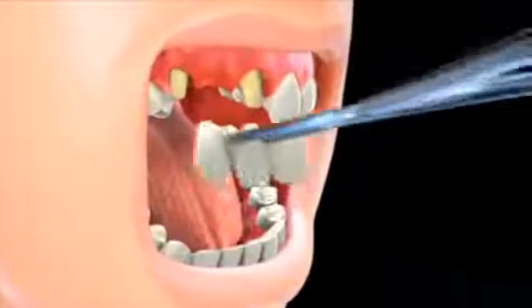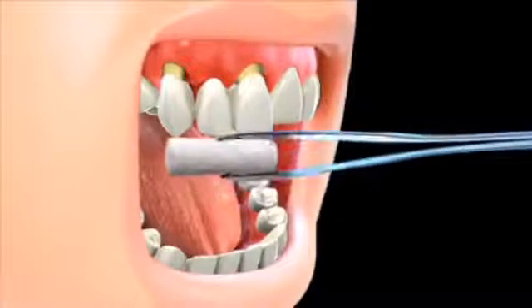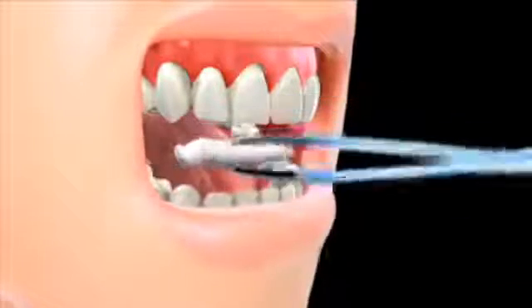In most cases, on your second visit, the permanent bridge is placed and adjusted to ensure proper fit and function. If the fit of the bridge is satisfactory, your dentist will proceed with permanently cementing it into place.